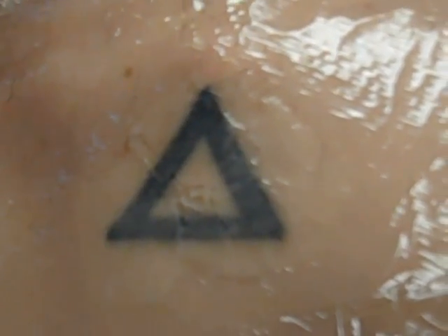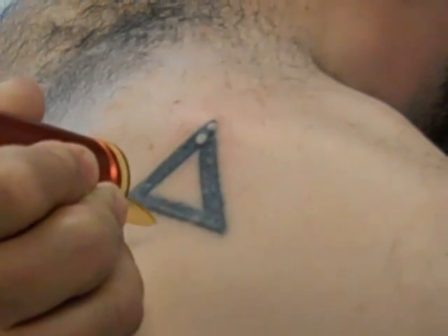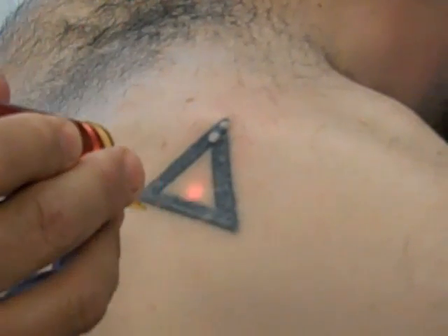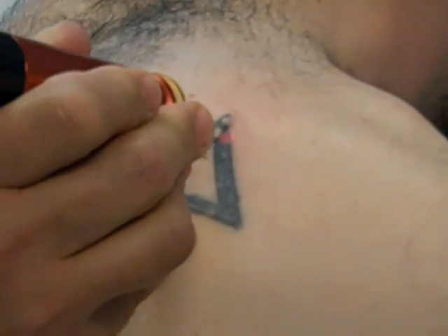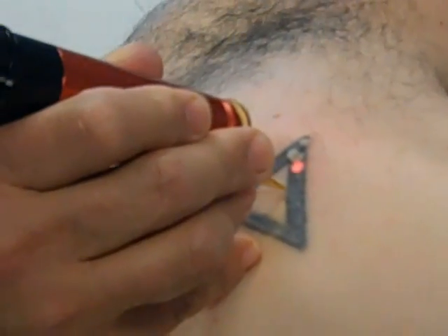We're going to show you an example of a typical laser treatment with the TriVantage laser from Candela using the alexandrite attachment. We've applied topical anesthetic cream, and I'm going to put some saran wrap over it for about 10 or 15 minutes to help it penetrate. Here it is with the anesthetic applied and the saran wrap. So this is the alexandrite 755 nanometer Q-switch laser from Candela. It's called the TriVantage. We're doing it in the alexandrite mode, and this is a tattoo that we treated before.